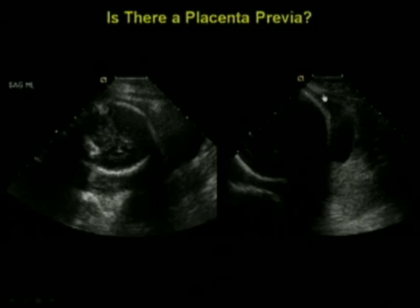Similarly in this case, this is a sagittal view, low. There's the baby's head, a little bit of amniotic fluid. You can see part of the cervix, part of it is shadowed. We just can't see things well enough to decide whether or not there's a previa. So what do we do? Do we send the patient away and report that we can't tell? Well, again, that wouldn't be doing anybody any good. But fortunately, there are things that we can do to get an answer.